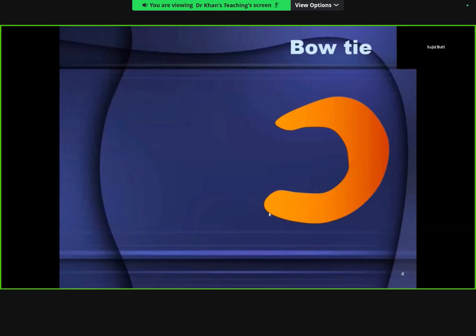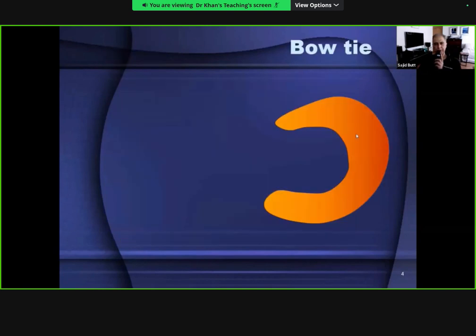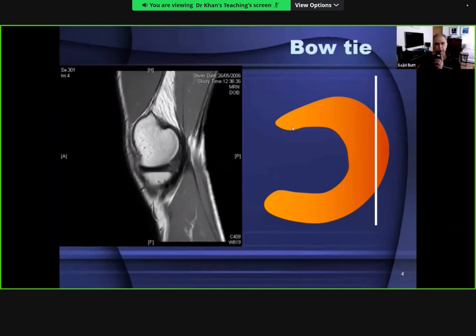The important mnemonic helps us remember the meniscus arrangement. The meniscus is a semi-lunar shaped structure, and in sagittal imaging it gives the appearance of a bow tie. Looking at the meniscus from the top, if you draw a sagittal image through the peripheral part, you can see the meniscus - anterior and posterior - shaped like a bow tie in low signal intensity.